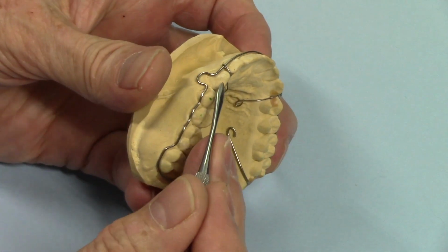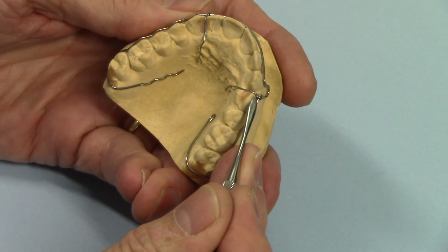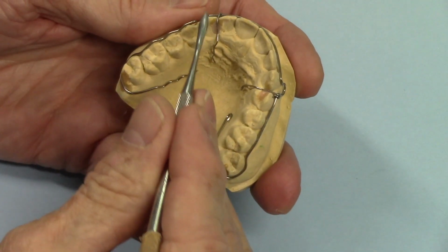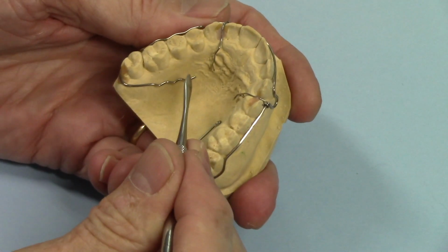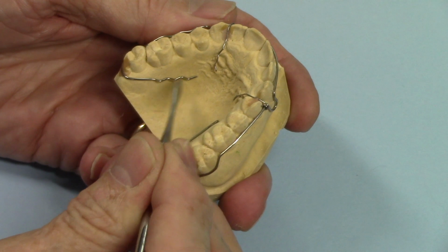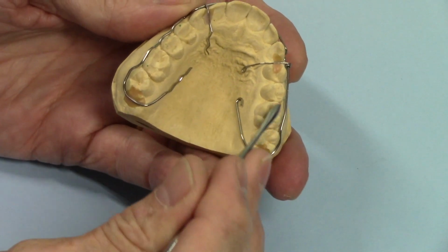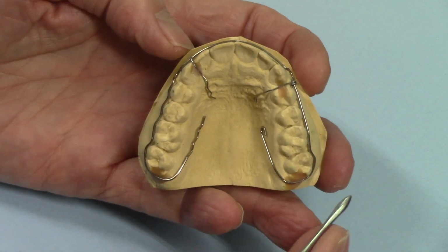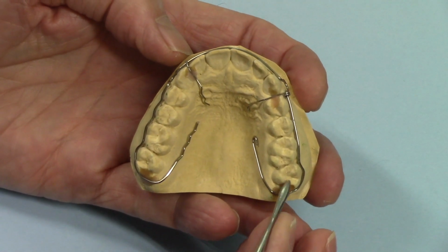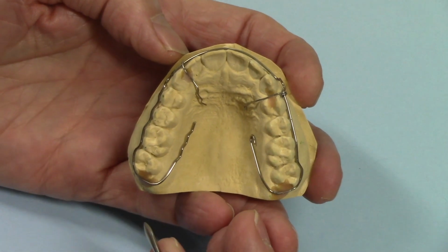These auxiliary support wires, they can be a single loop like that, or they can wrap all the way around like this one. And typically you'll bend the loop and then slide it over the wire. And if it's a zigzag anchor bend, you can just slide it over very easily. If it's a loop, you need to leave the loop open so you can slide it over, and then you can close the loop if you like. So now I'm going to show you some designs of this basic wraparound retainer without the need of the auxiliary support wires.